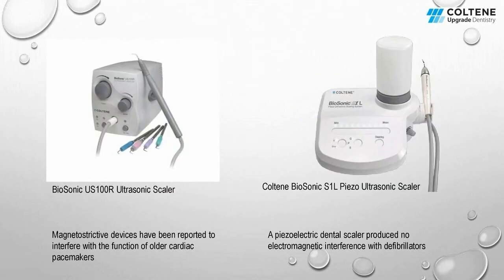So these are the two types of ultrasonic devices as I've mentioned in the previous slide. One is the magnetostrictive, that is the Biosonic US100R, and the other one is the Biosonic S1L piezo scaler. The basic difference between them I've already mentioned in the slide, but in the literature it has been suggested that the magnetostrictive devices have been reported to interfere with the functioning of older cardiac pacemakers, but the newer ones have been modified slightly to bypass that. Apart from that, the piezo ultrasonic scalers do not have any kind of offset as such, and they are very good instruments to work with.